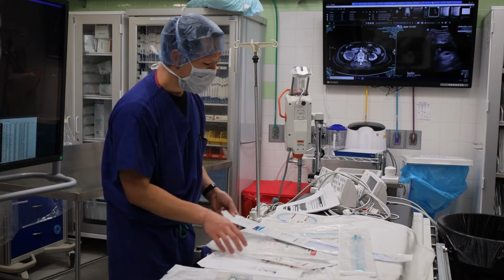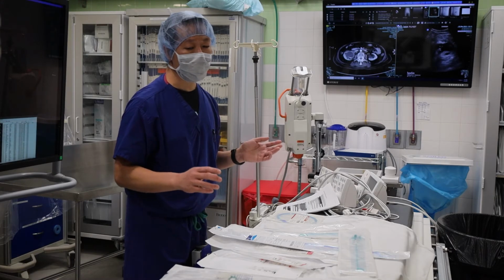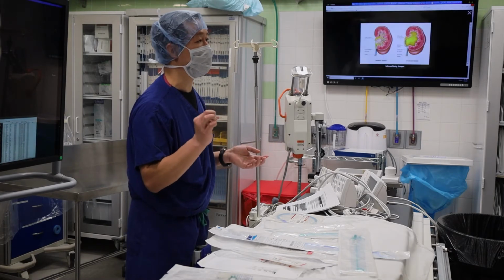Thank you. At least that's what I was taught a long time ago, is that correct? Yeah, I mean, the thing is, every time we put on connectors, including 3-ways, oftentimes the lumen is smaller. No, really, it's just a one-way.